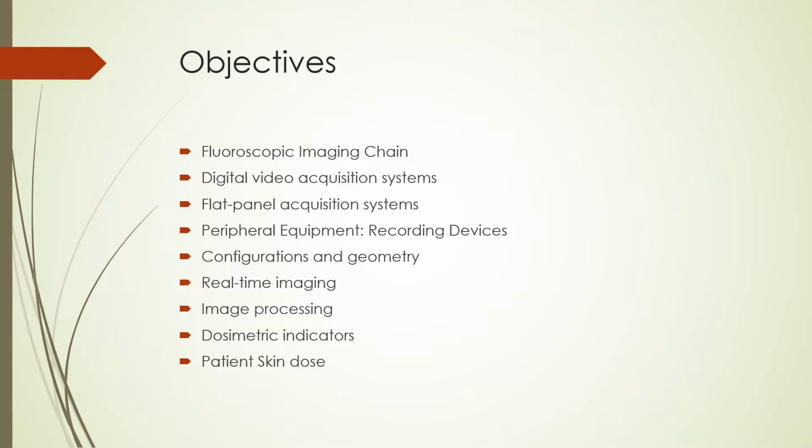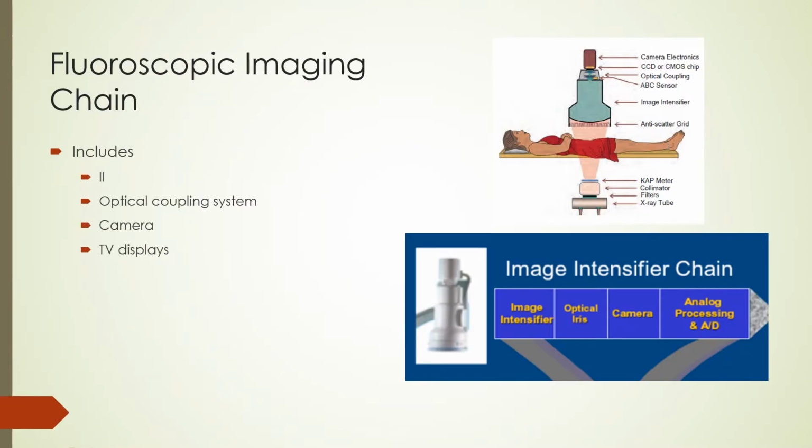Students will learn about real-time imaging modes. We shall also learn about image processing tools used to reduce patient dose and the trade-offs with image quality. We shall finish with dosimetry and patient skin dose indicators. We shall start with the fluoroscopy imaging chain.